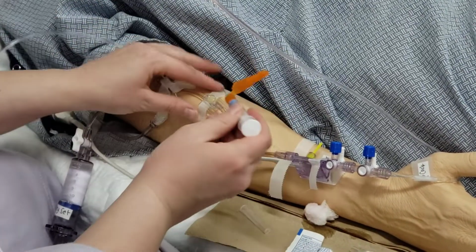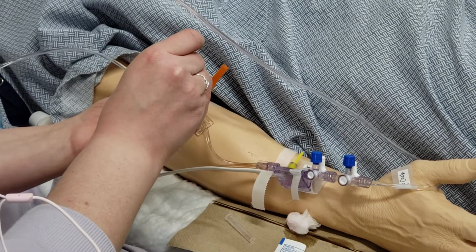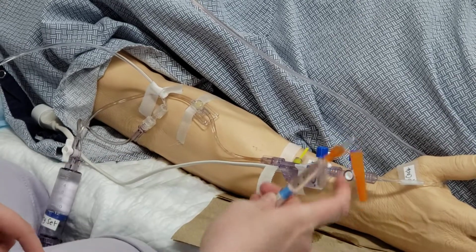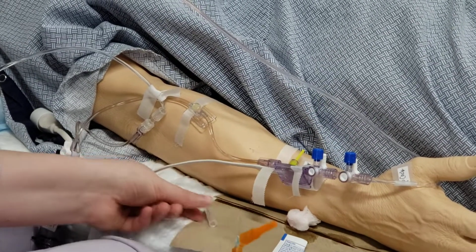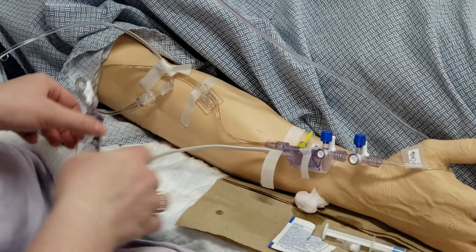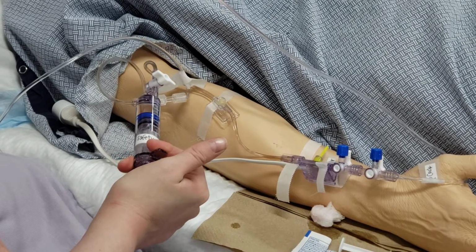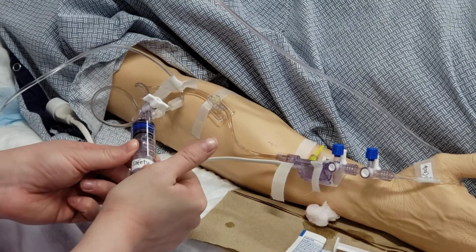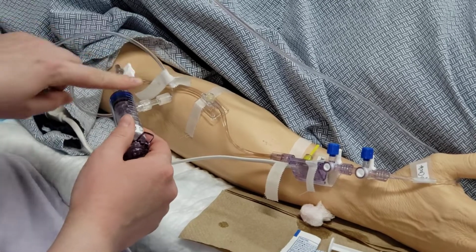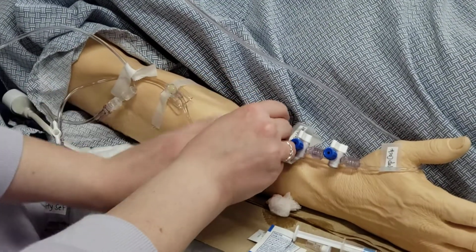Take your ABG needle. Go ahead and stab it. Draw back. Pull back. Close your needle. I want you guys to reuse this. Clean it. Open your syringe back up. Push the waste back. Close it. You close this syringe again so that it's pointing and is closed off. Otherwise, this will fill up when you go to clear your line with the pigtail again.